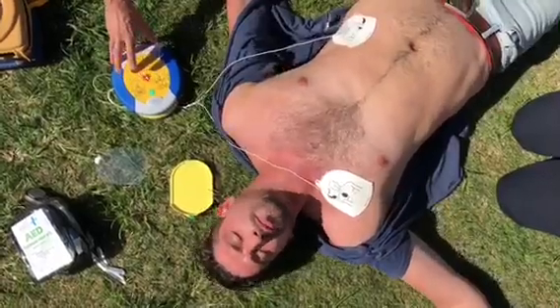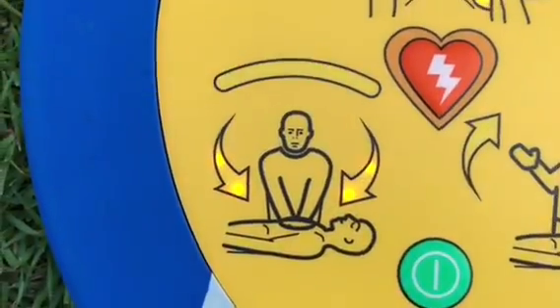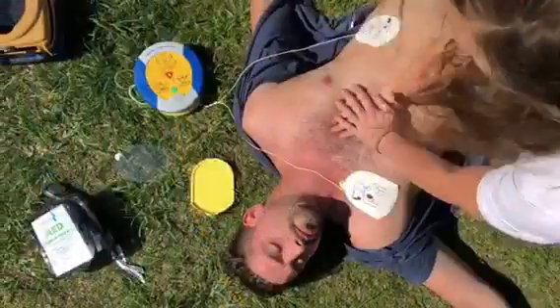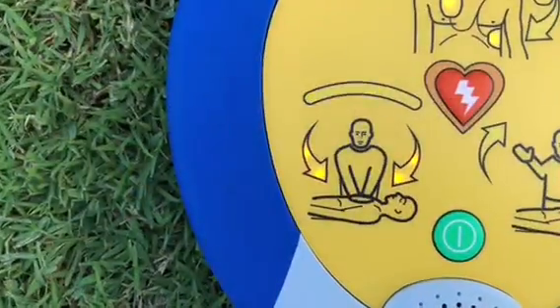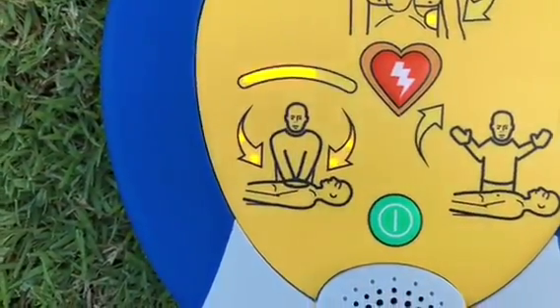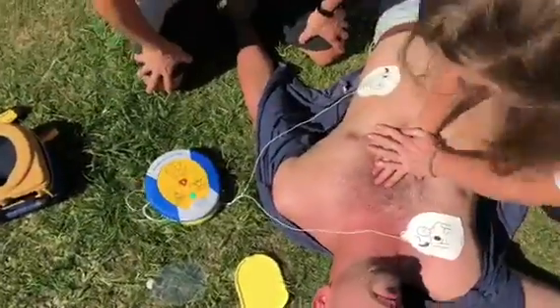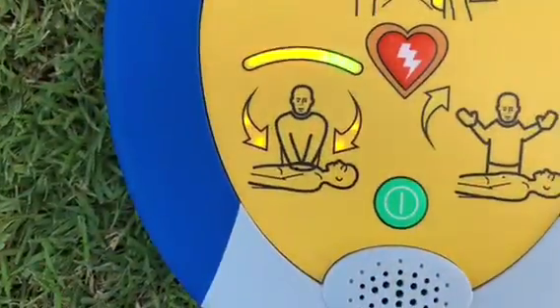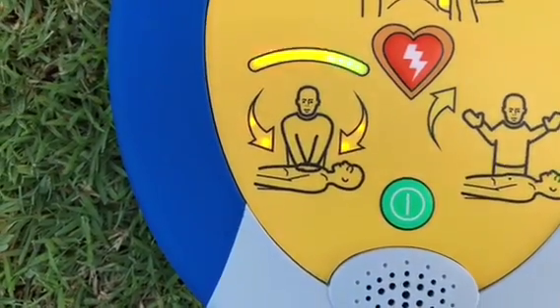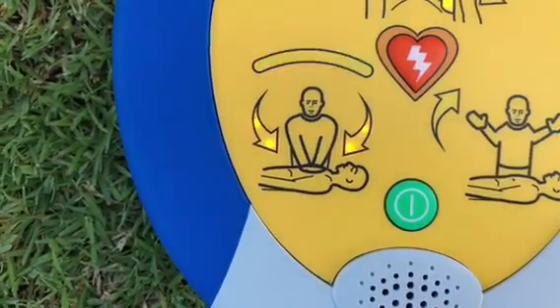Shock delivered. Begin CPR. This defibrillator has a metronome to help you with your CPR. The voice prompts will tell you to push faster or harder if required. Push harder. The voice prompts guide you to achieve good quality CPR with rate and depth, and the LED indicator also shows you.